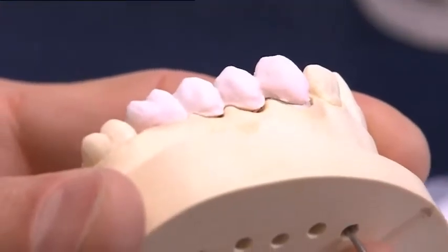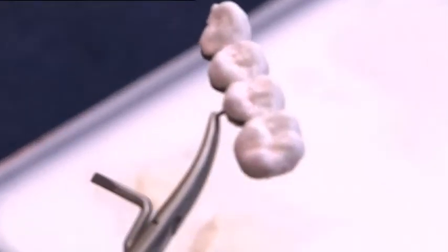The available space and functional occlusion are checked in the Stratos. After carefully lifting the bridge from the model, the contact points are supplemented with dentin and incisal material.